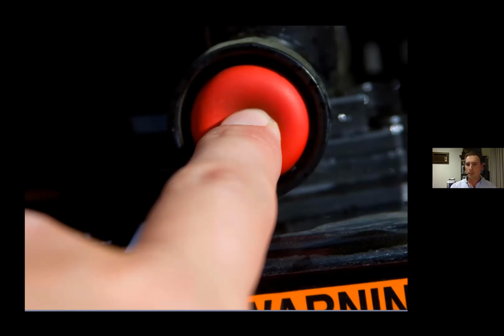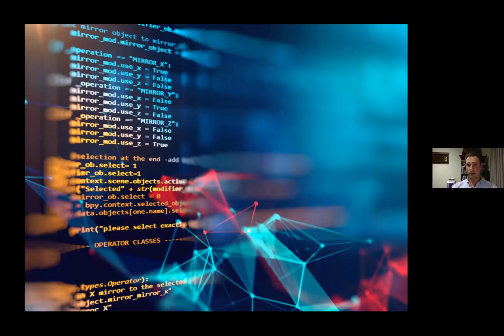So I describe to my patients that shockwave sort of hits the reset button on these injuries, and this can be really helpful for these chronic cases. And there's 2 types of reset that I explain to them, and they have different effects. One is we're resetting the software. And resetting the software is where I'm talking about the reduction in pain that patients feel immediately after treatment. And this is the depletion of substance P. This is the desensitization of the area. This isn't the healing response.